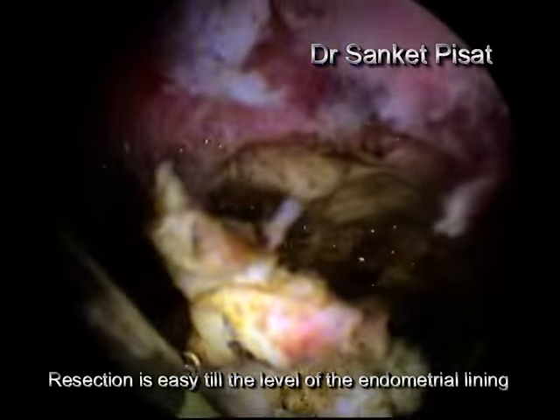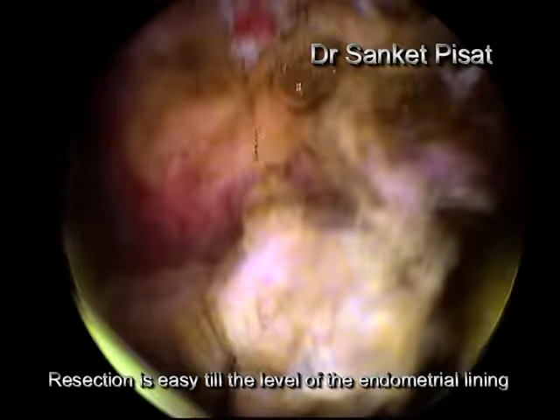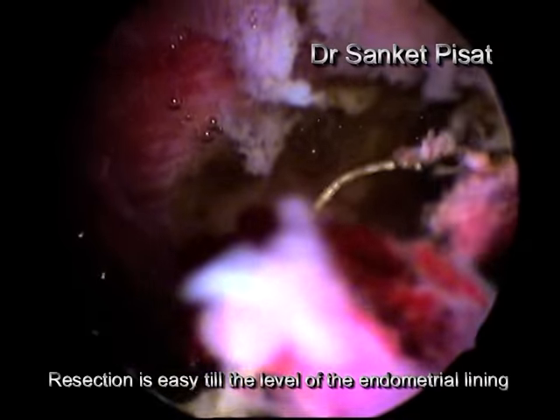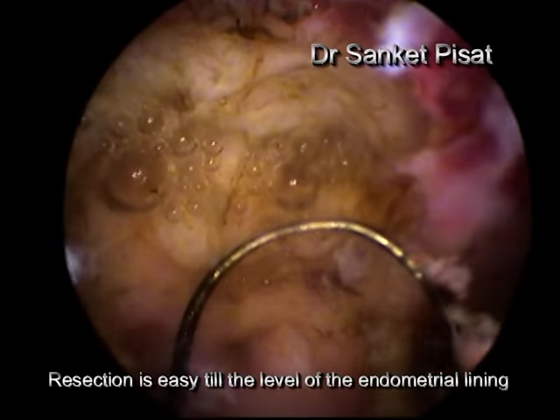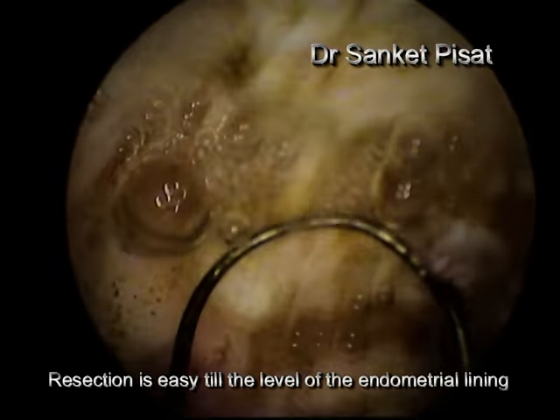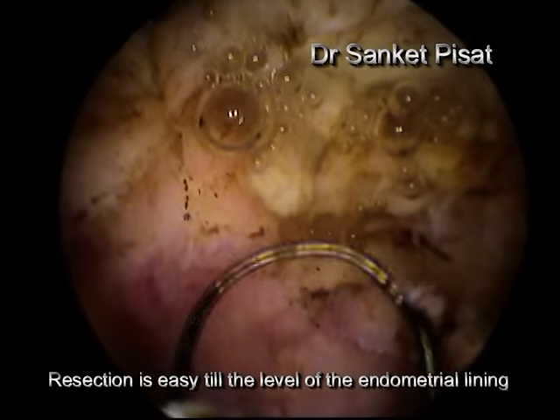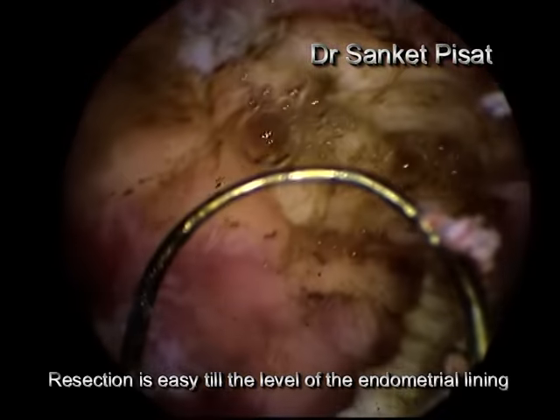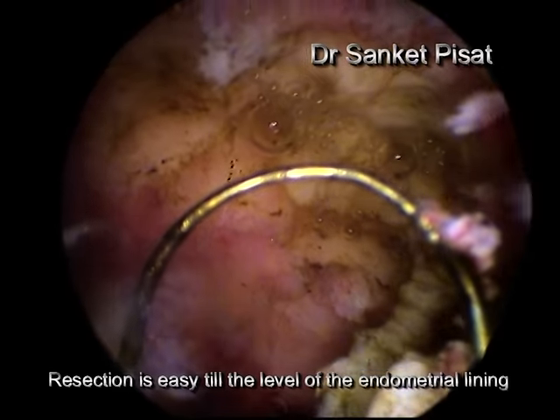However, at the endometrial lining, where the fibroid is flush to the endometrial lining, the surgeon is faced with the dilemma of either cutting into the myometrium to scrape out the fibroid, thereby increasing the risk of perforation, versus leaving a part of the fibroid behind.